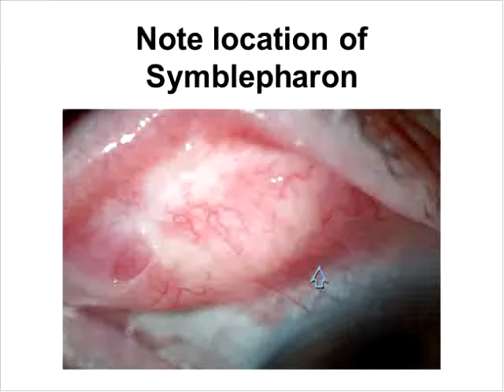And this is a case of ocular cicatricial pemphigoid. You can see there is not much room. This is pretty much all connected. I was still able to fit a device in this eye, but basically it was a small diameter, and what's very important in these situations is to have the edge very well tapered so it's not too sharp and not too thick to exacerbate that tissue.